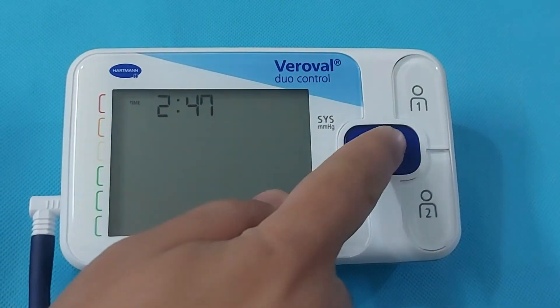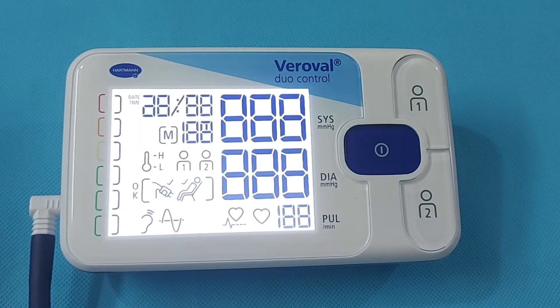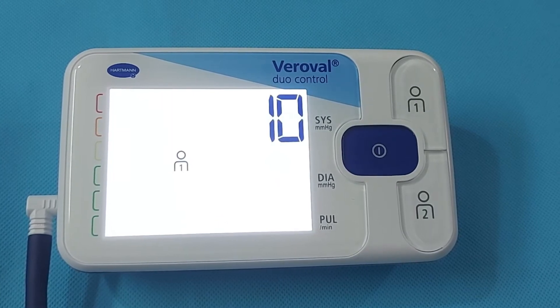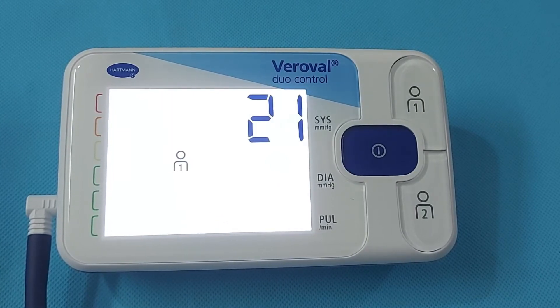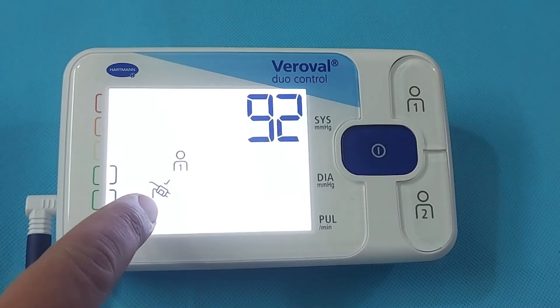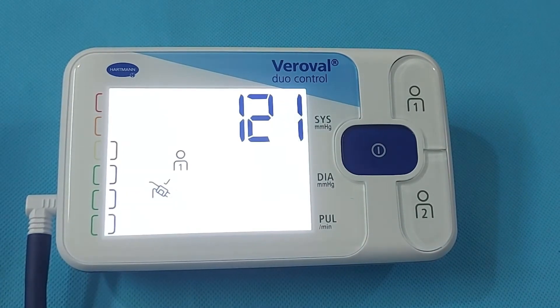After you choose the user and press the Power button, the blood pressure measurement will start. Below the user indication, you will see the sign of a wrapped inflating cuff, which will indicate whether you have placed the cuff correctly or incorrectly.